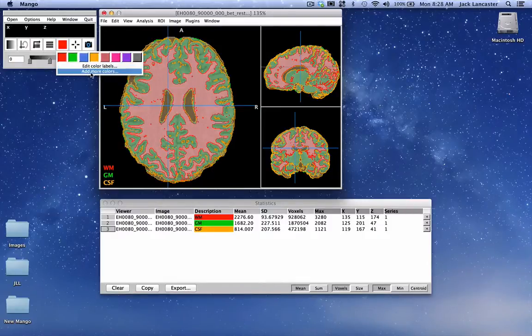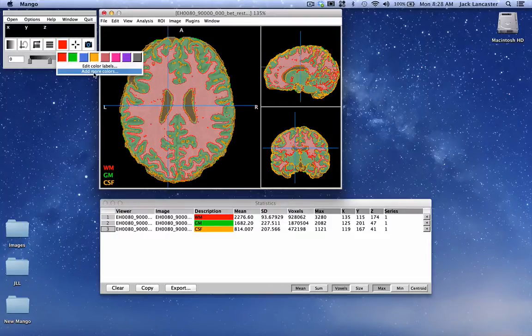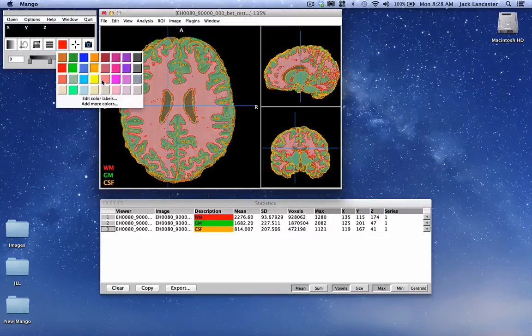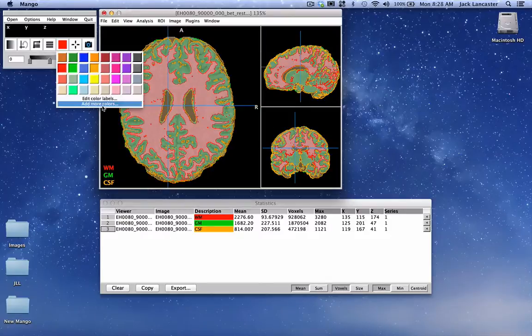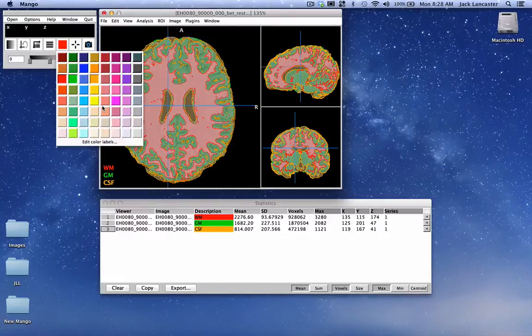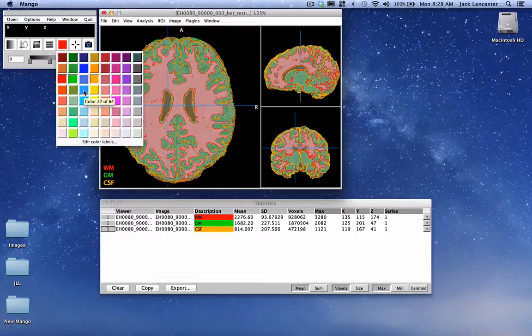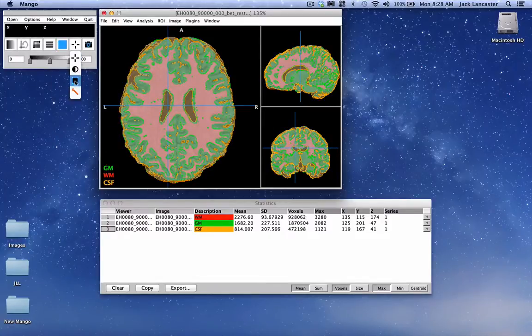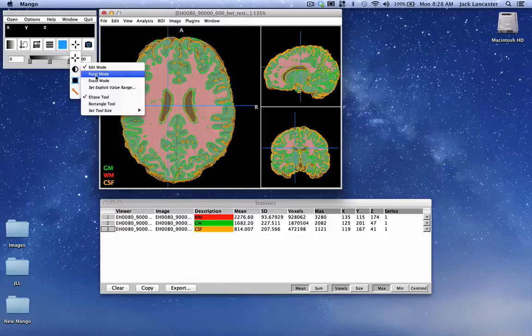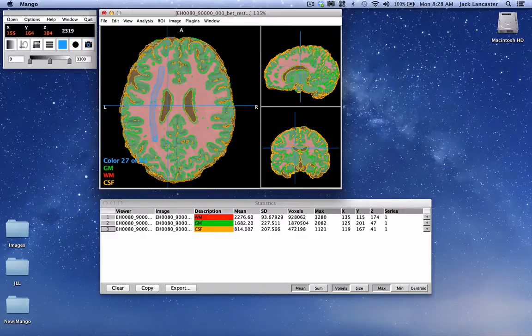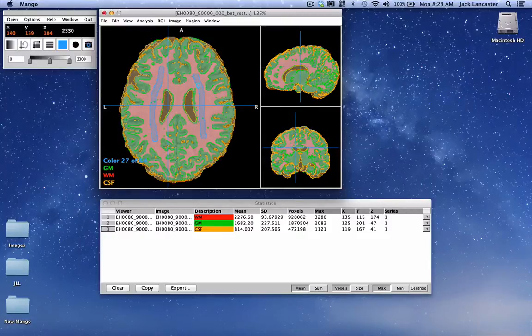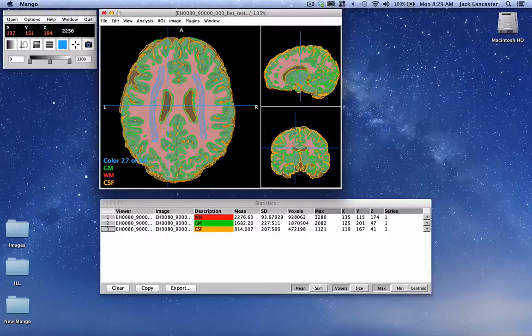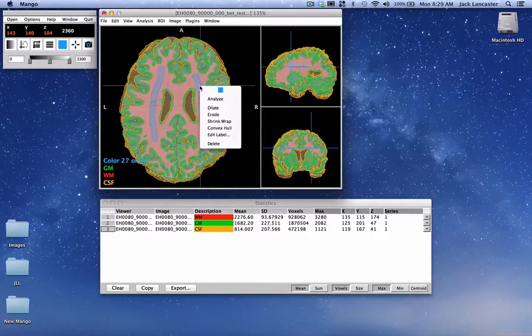The other option in the color palette is to add more colors. Mango now supports up to 64 colors and correspondingly 64 ROIs. Each time you pick to add more colors it doubles the capability, so it went from 8 to 16, 16 to 32, now here's all 64. I'm picking this because I want to illustrate some other uses. We're going to put in a couple of other kinds of regions.